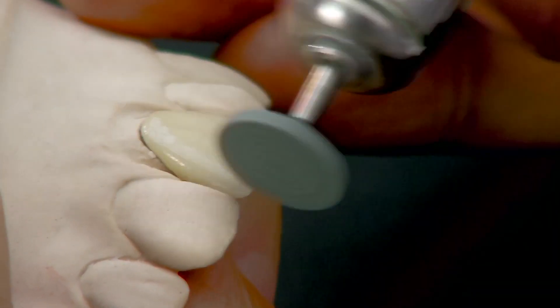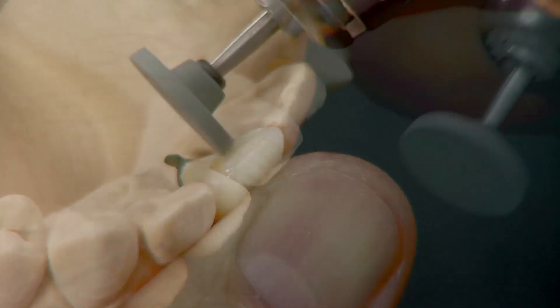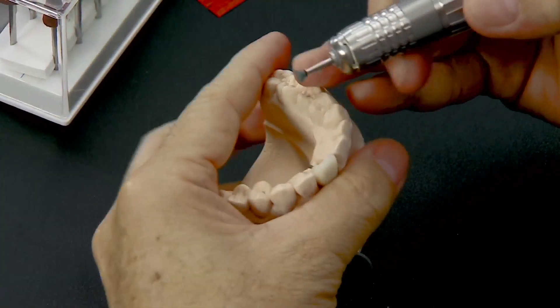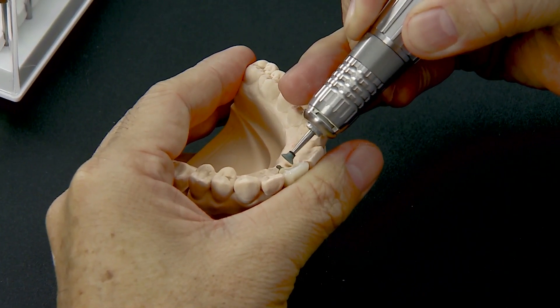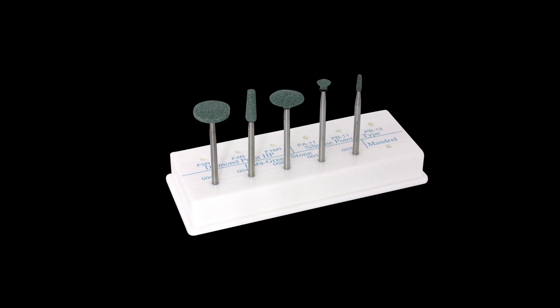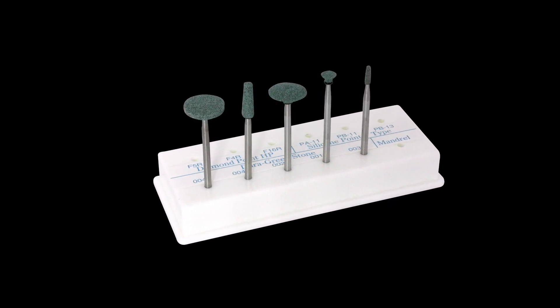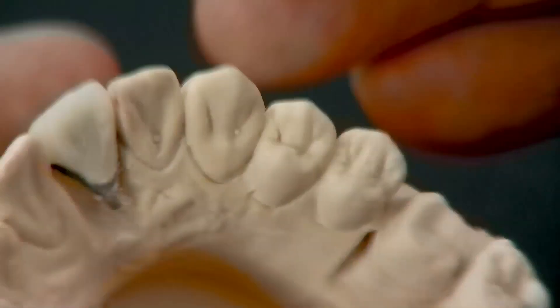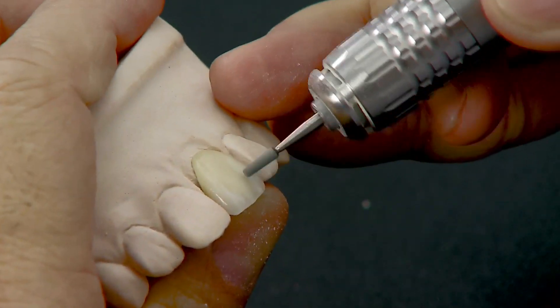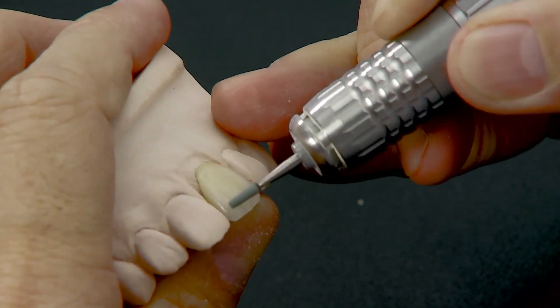Ensure that the crown is seated properly in the die. Adjust the labial and palatal surfaces with Dura Greenstone WH6. Shape the palatal fossa with Dura Greenstone IC3, which is easy to adapt into the concavity. Dura Greenstones are available in a variety of shapes to adapt to different surfaces of the tooth. Contour the developmental grooves with Dura Greenstone TC4 and define the fine details on the crown with Dura Greenstone TC1.